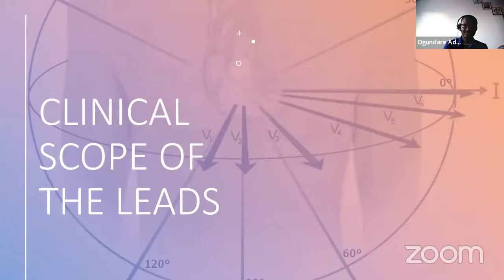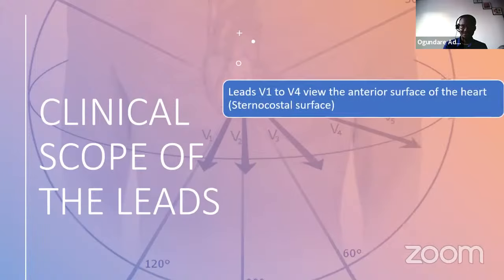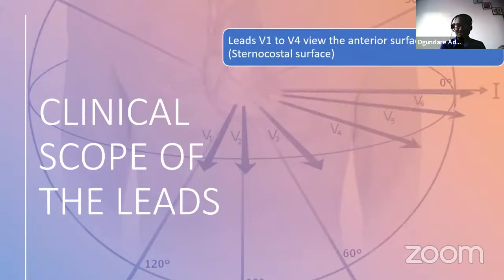Okay, so the clinical scopes of the ECG leads. V1 to V4, these are the anterior leads. They view the anterior surface of the heart, and I want you to put that down if you are making notes. What that means is they tell you whatever is going on in the anterior, the sternocostal surface of the heart.